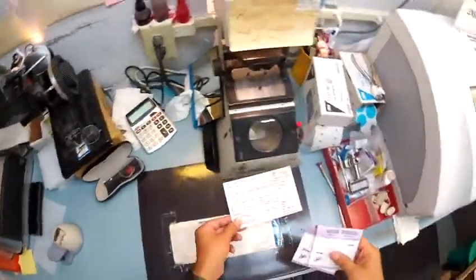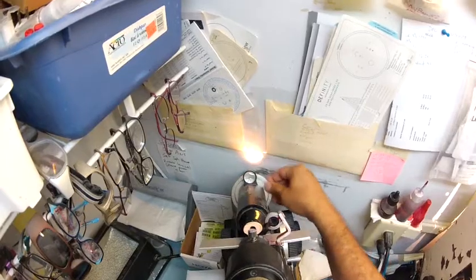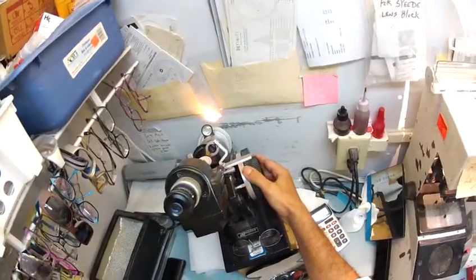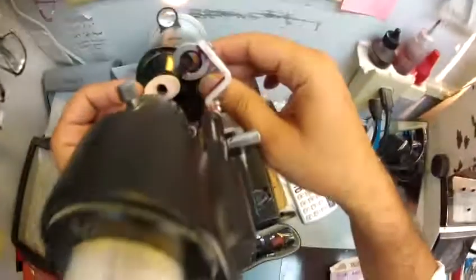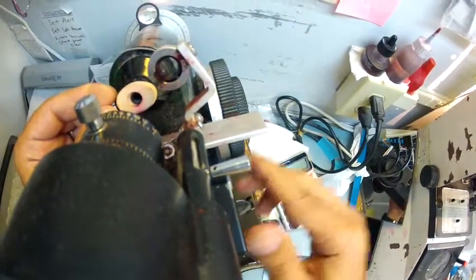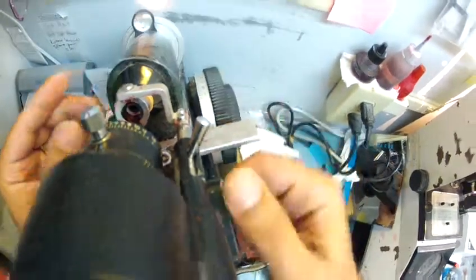So your right eye reads +1 -75 at 7. I'm going to spin the axis wheel of my Marco 101 lensometer to 7. I'm going to put the power drum on +1. Actually, let me zero it out and make sure everything is perfect. Yep, now I'm going to put it on +1. I'm going to put your lens in and rotate it until the sphere power comes in clearly. Check your astigmatism correction. That looks good, and I'll explain all that in just a little bit.